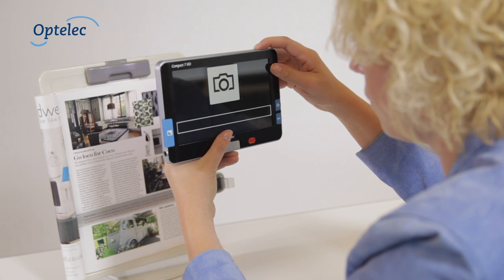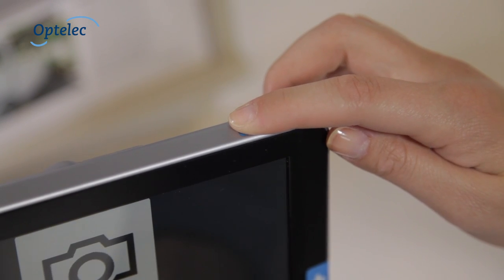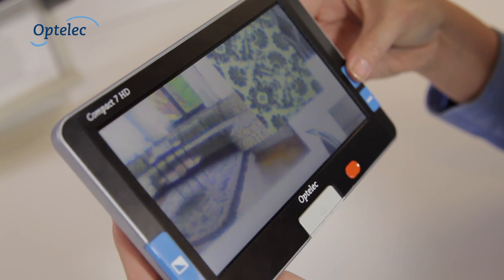You can also use the Compact 7 HD to take photos. Press the Photo button to take a picture. You can view the photo you have taken at your convenience.